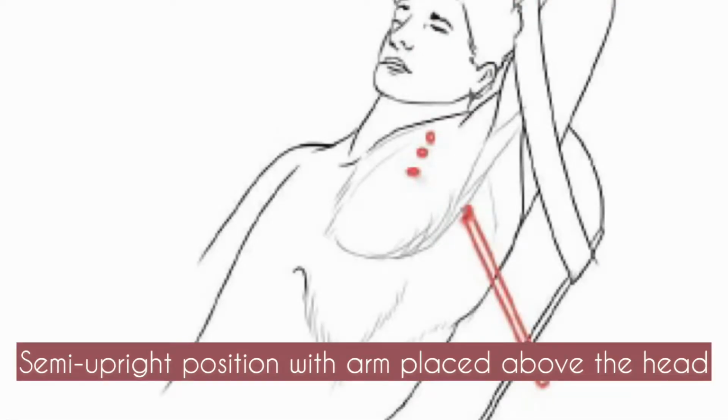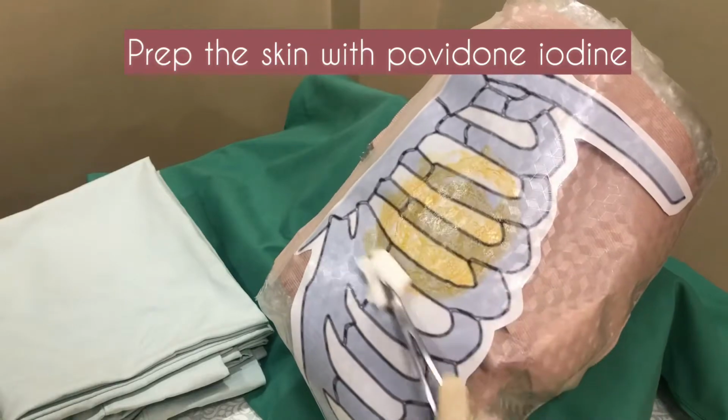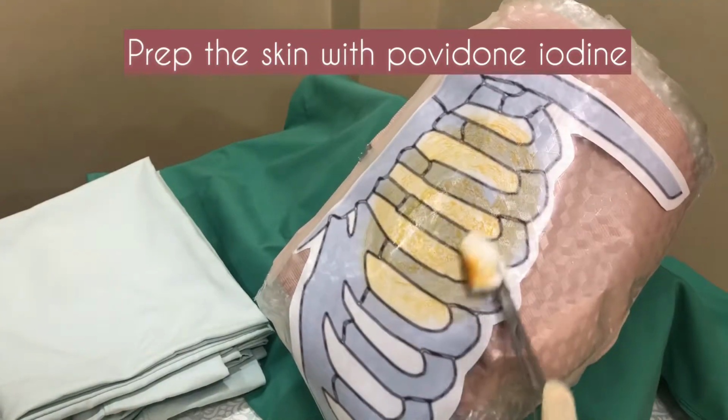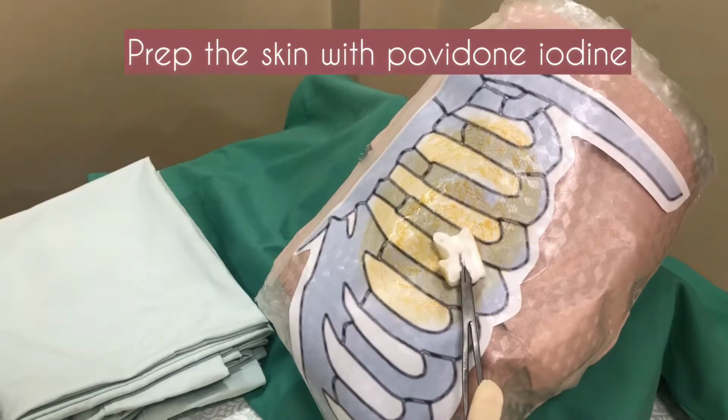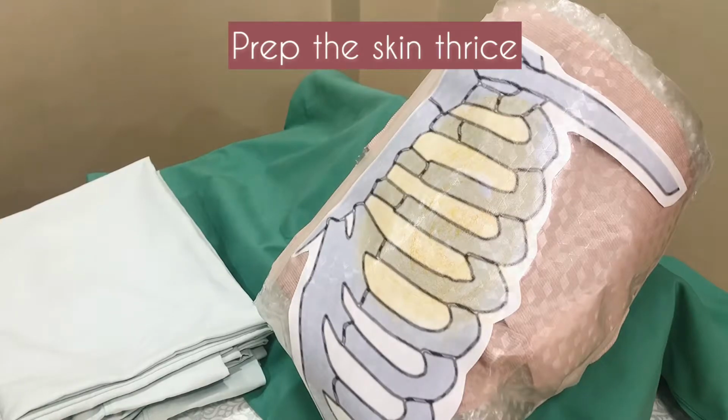Procedure. If possible, have the patient assume a semi-upright position with the arm placed above the head. Next, prep the skin over a wide area of the chest wall with povidone iodine. Remember to do it in an outward concentric motion.